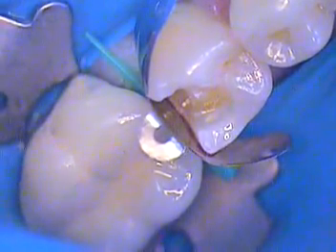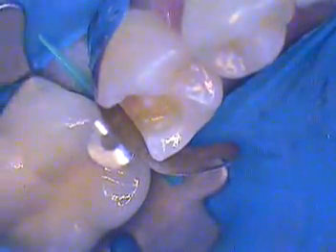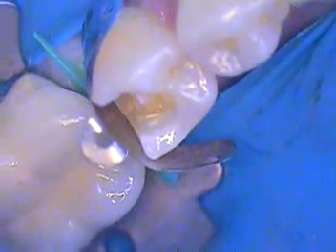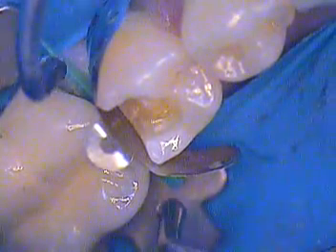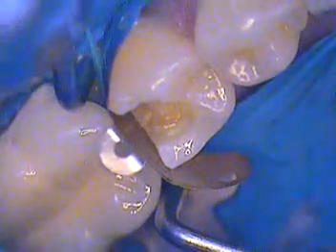We're going to dry that off because we've got a little bit of percolation going on. Take a good look all the way down and make sure you've got a good seal. That looks great. Now we'll put our clamp in place — this is the Garrison clamp, it's the original clamp. Try to get behind the wedge if you can; that'll be great because you can get the best of both worlds — a good seal and good contour.